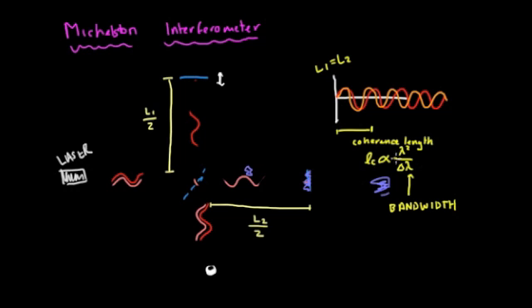But if we have sort of a medium, then we can recover interference for a short distance, and that is what we call the coherence length, and that is really what the resolution of OCT is, the coherence length of the light. So how are we using this? Well, let us just look at an example where we have maybe a few layers of tissue.